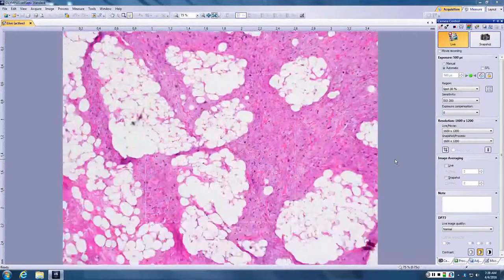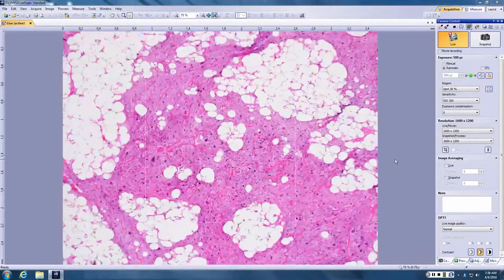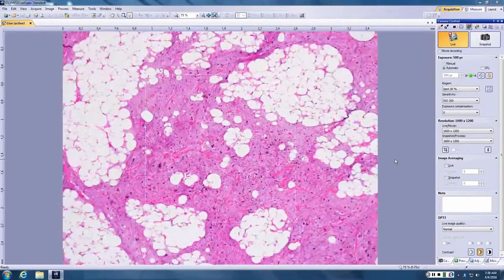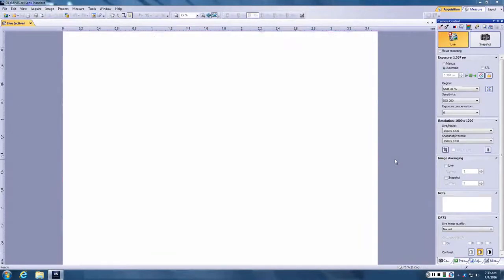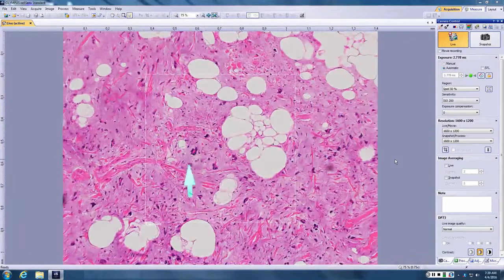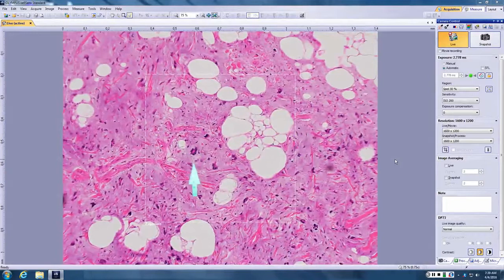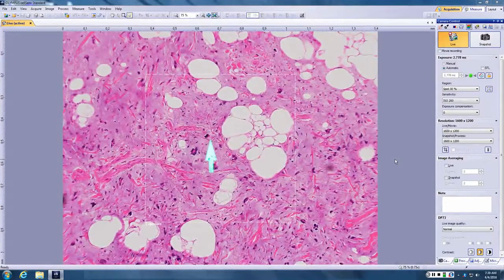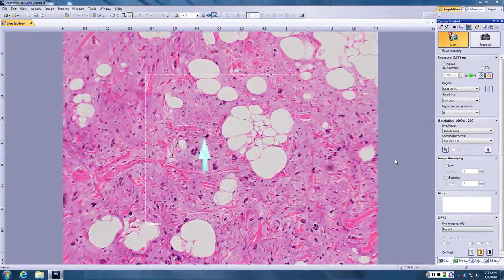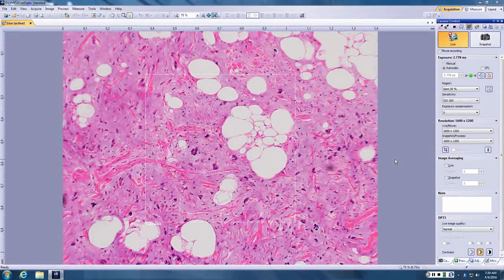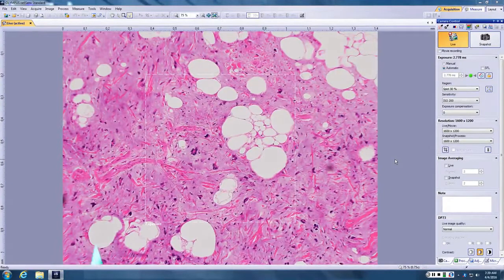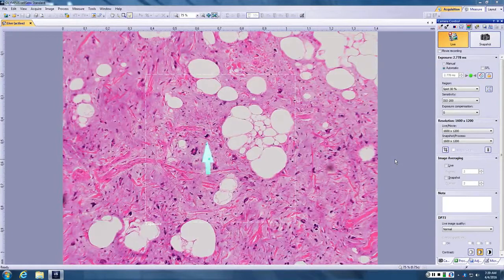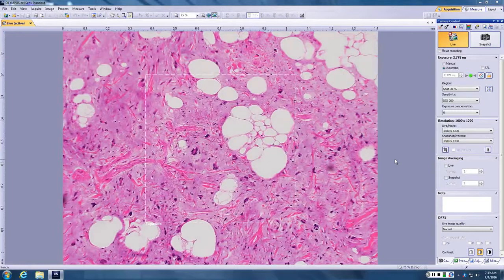Okay Rob. So what are the features of a pleomorphic lipoma? You do in fact see floret giant cells which are these wreath giant cells with overlapping hyperchromatic nuclei. You also see stellate hyperchromatic cells that look somewhat like radiation fibroblasts, and then your background is fat, myxoid tissue, ropey collagen just like a spindle cell lipoma. So it's basically a background of spindle cell lipoma superimposed upon which are radiation-like fibroblasts and floret giant cells.